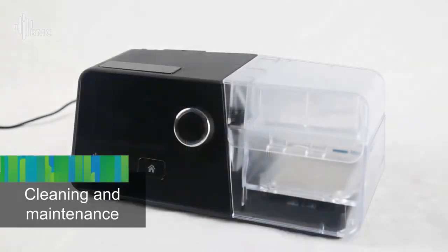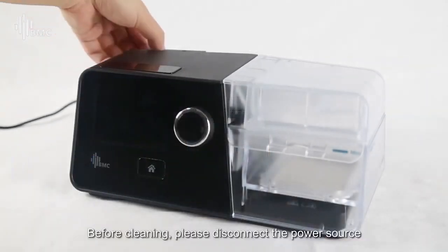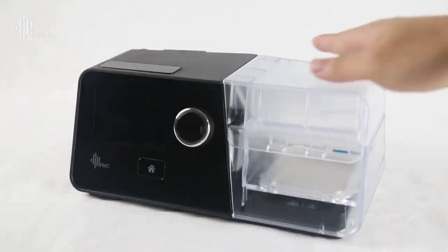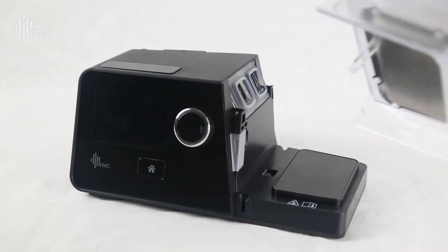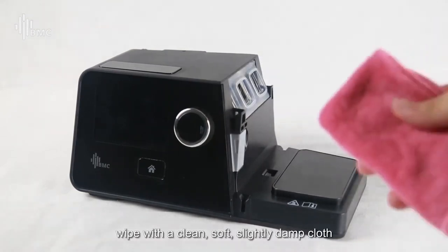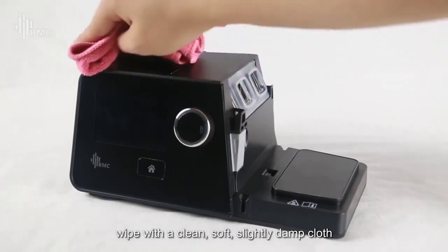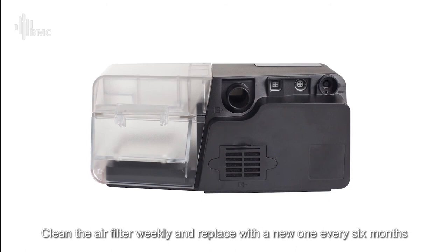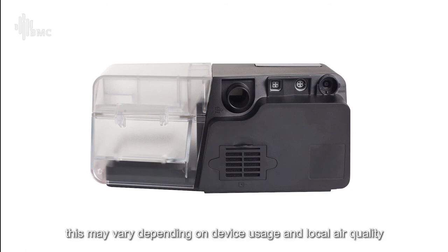Cleaning and maintenance. Before cleaning, please disconnect the power source and ensure the heating plate is cool. When cleaning the device surface, wipe with a clean, soft, slightly damp cloth. Clean the air filter weekly and replace with a new one every 6 months. This may vary depending on device usage and local air quality.